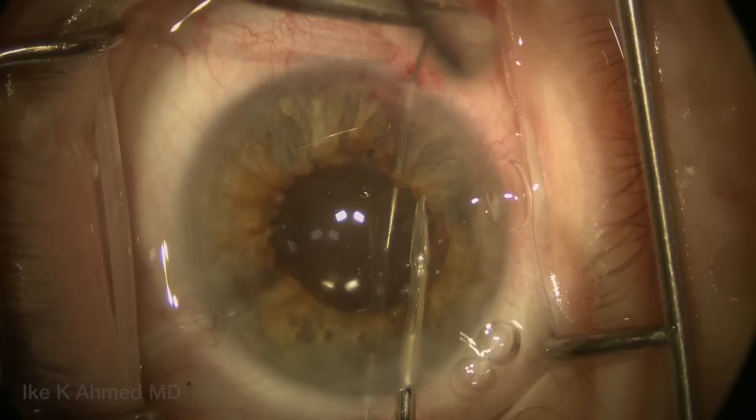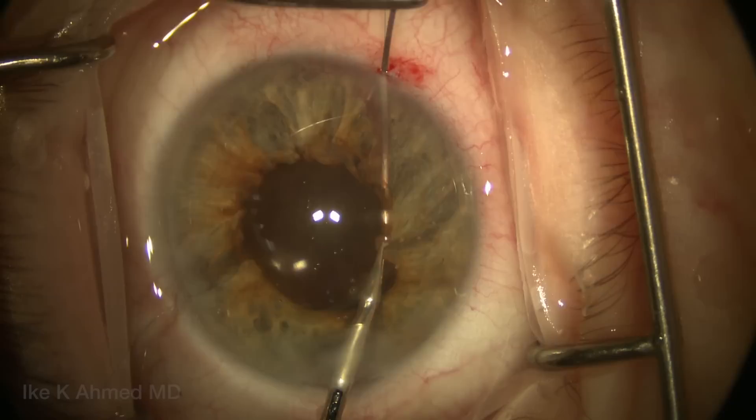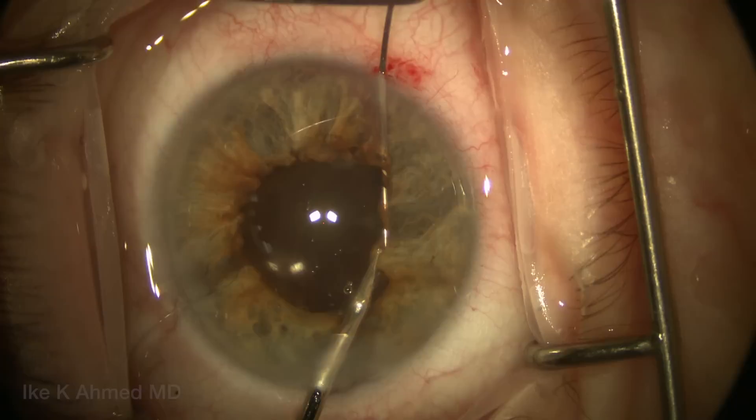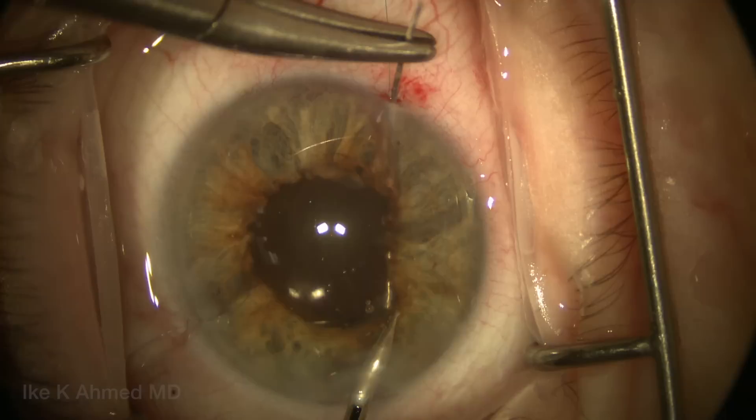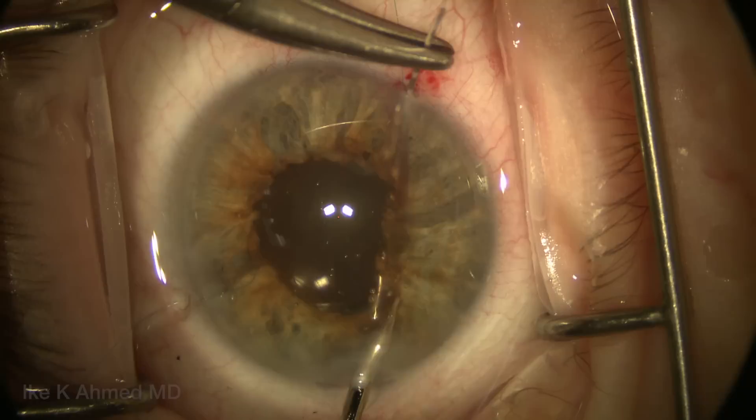We continue the baseball running suture technique with the assistance of the micro grasper to present the iris to the needle. In this case, the needle is fairly stationary and the iris itself is being manipulated to bring it to the needle tip — this is more controlled, as it's often difficult to control the needle in the anterior chamber moving back and forth without coming out of the previously passed tissue.